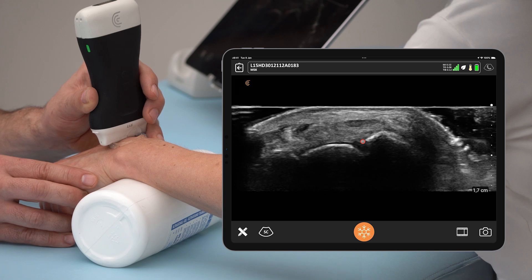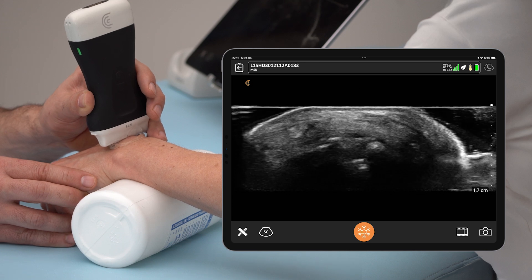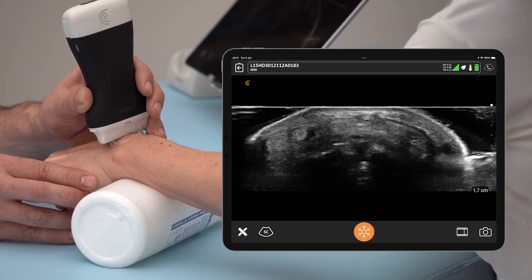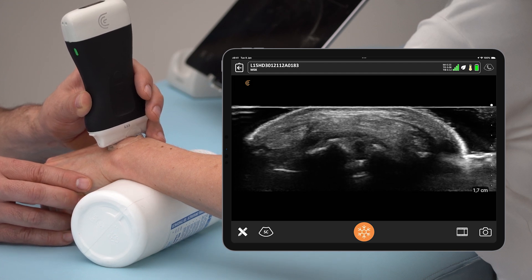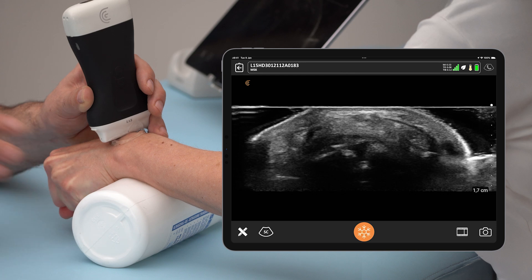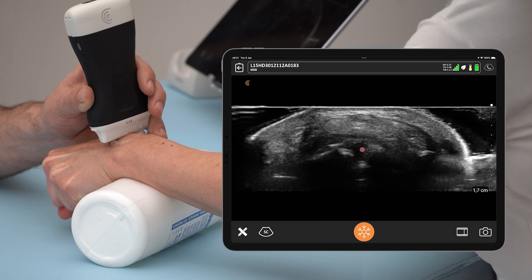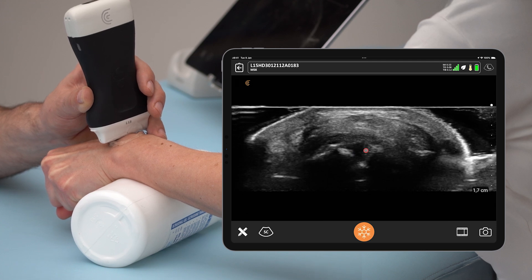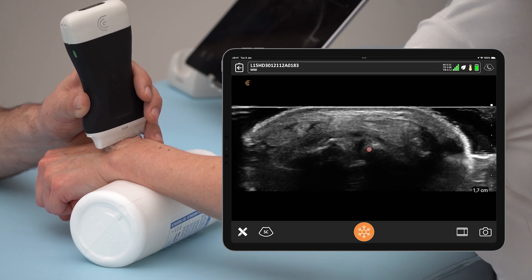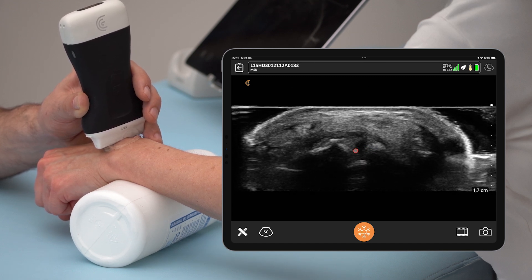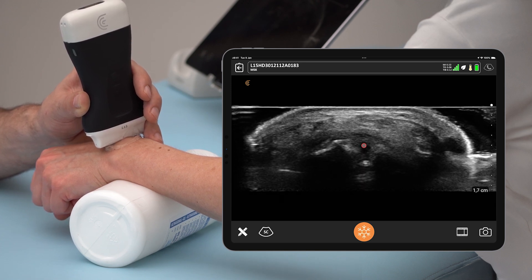After ulnar deviation, we ask the patient to clench the fist slowly. The patient is now clenching the fist — please let go and clench again. We are observing the joint width, the degree of gapping, and the degree of instability between the lunate and scaphoid bone. If there is instability, you will see clearly that these two bones go apart, the joint width becomes larger, there is gapping, and you will also see opening of the ligament.